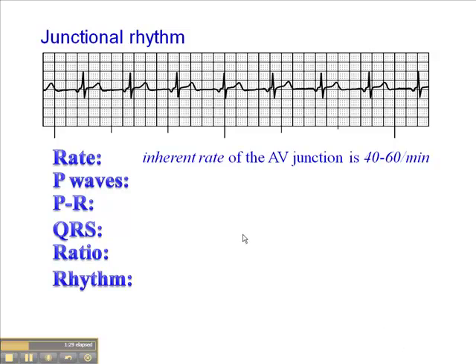Just out of curiosity, we'll calculate the heart rate. This QRS falls fairly close to a dark line, so the heart rate here is 300, 150, 100, 75, 60. So in fact, this is an example of an accelerated junctional rhythm.